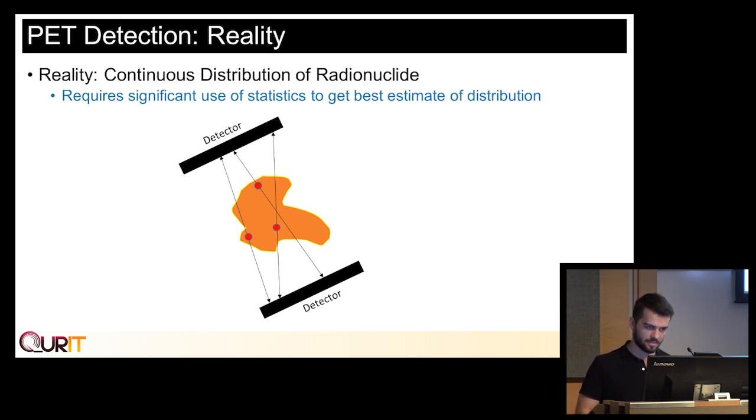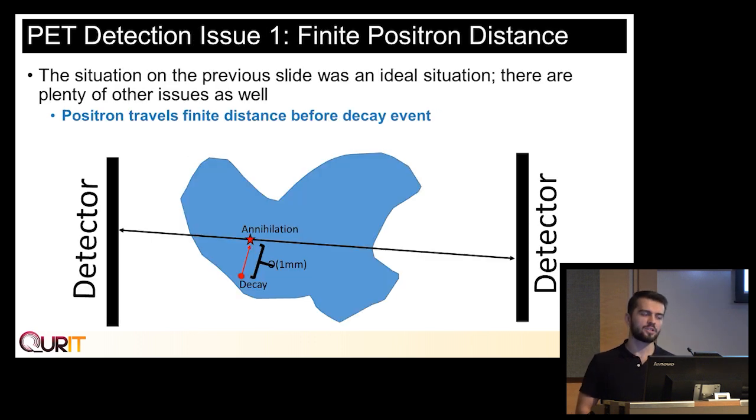It's a little bit complicated now. And so I want to go over a few detection issues that happen in PET.